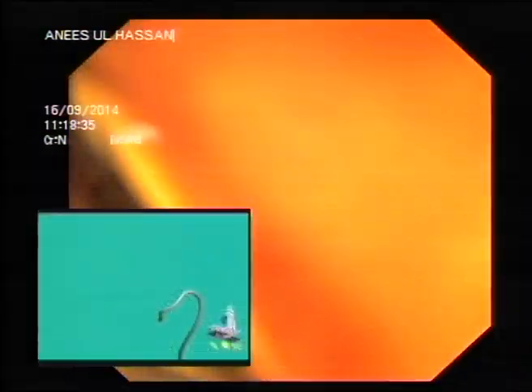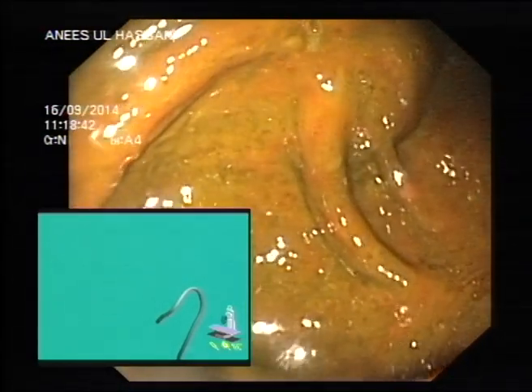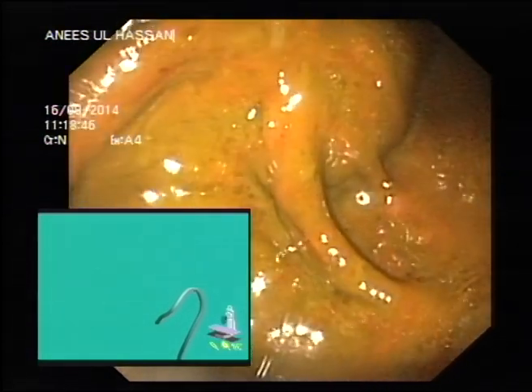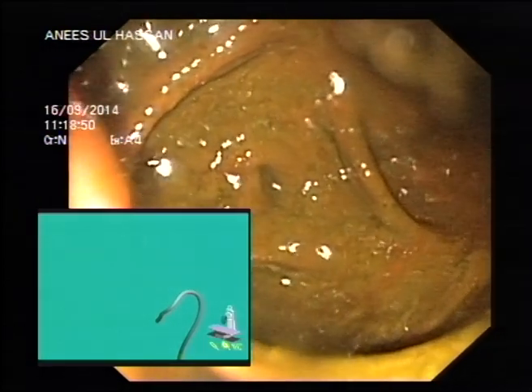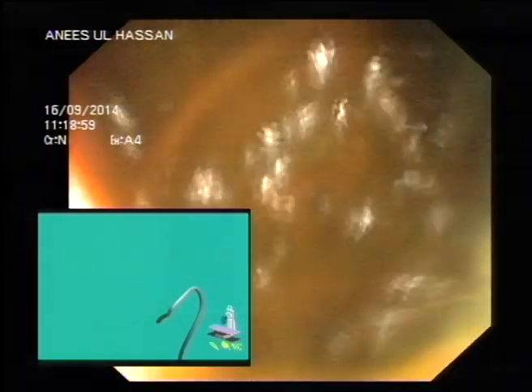हाँ, चलो। Looks like a relatively easy ileocecal valve because you can see the pucker. ठीक है, तो you can see appendix तक आप जाके, you go there and as you withdraw, you see the ileocecal valve at 9 o'clock position, and I can just see it coming into the view, right? So there it is, pucker.